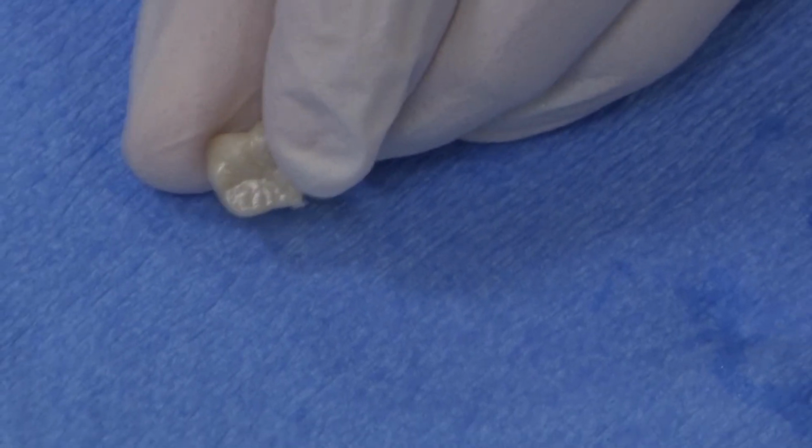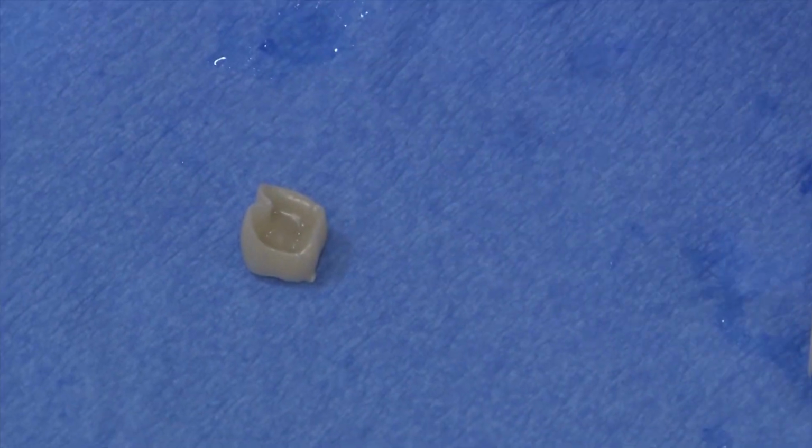So once again, we have our BruxZir crown. I went ahead and gripped the crown and just separated it from the mandrel. So we have our piece that we're going to get rid of.